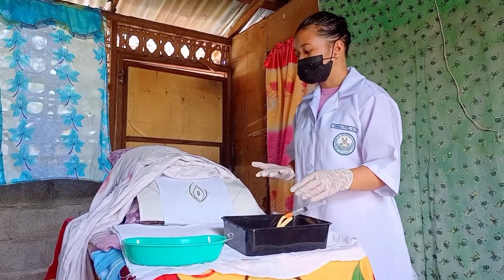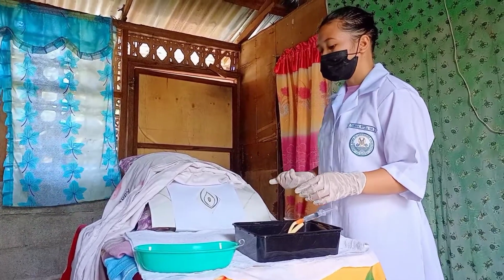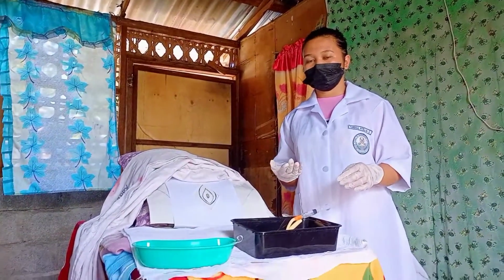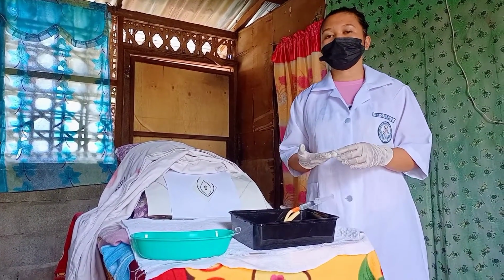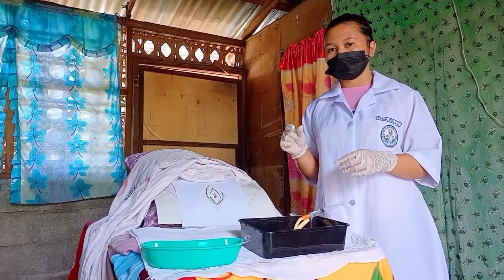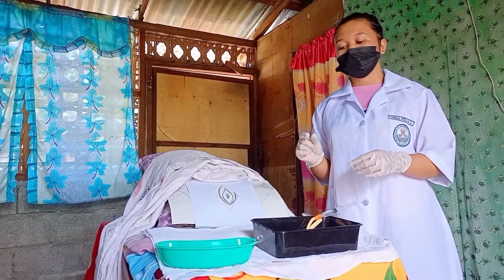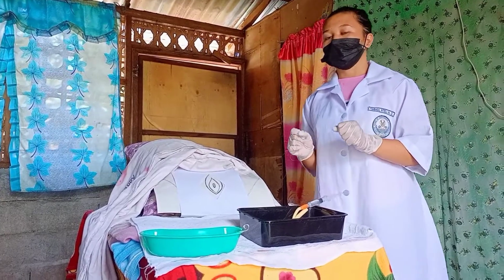So, to protect the patient from acquiring a possible infection, for women, place the non-dominant hand above the labia and with your thumb and fingers spread the patient's labia, pulling at the same time to expose the urinary meatus. If the labia slip back over the urinary meatus, it is considered contaminated. You will need to repeat the cleansing procedure.